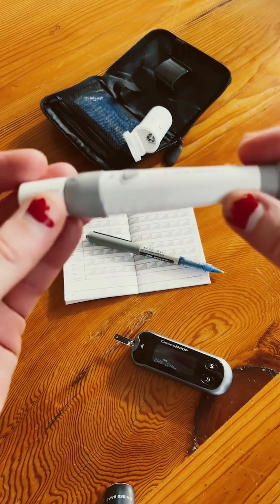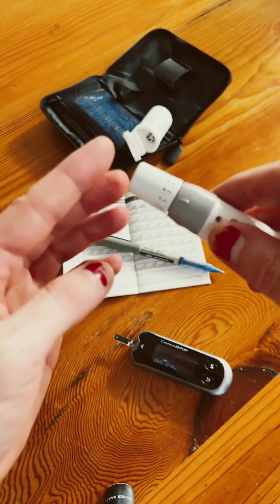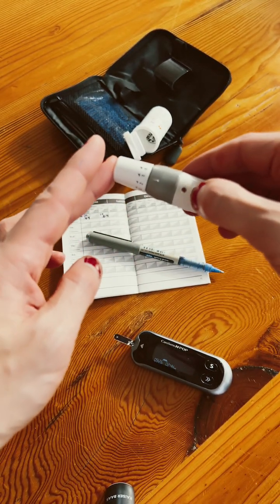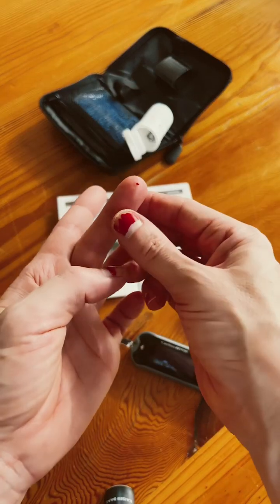Then you get your finger pricking device, you pull it out like this, pop it on the end of your finger and press this little triangle here — there we go — until a small drop of blood comes out.